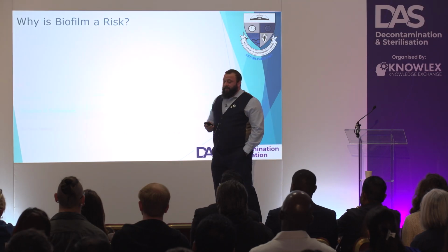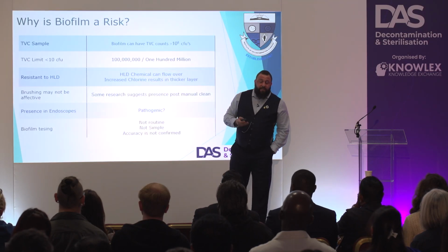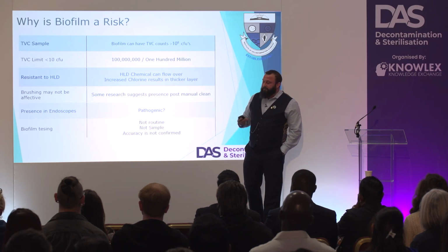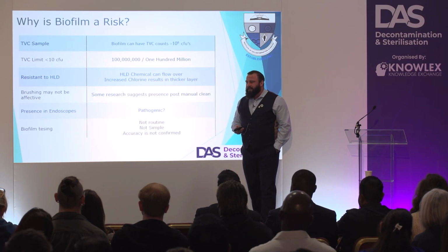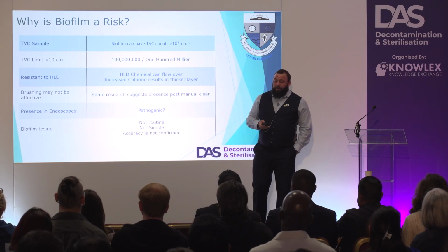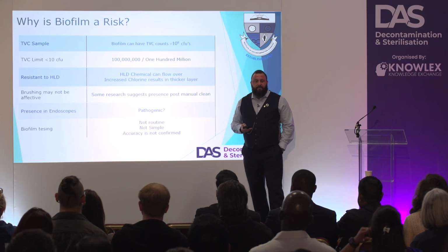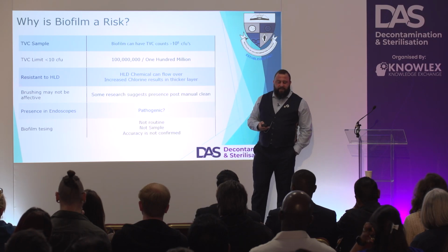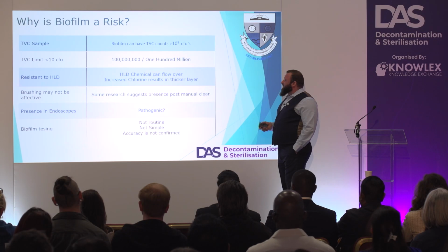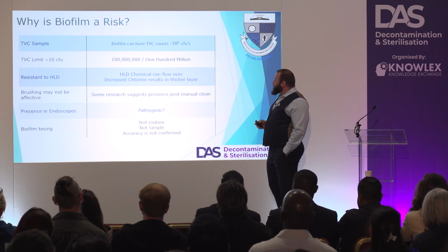So why is biofilm a risk? As we've already said, for TVC samples we have a maximum of 10 CFUs. Biofilm can contain 100 million CFUs, 100 million organisms released into your system. It's been proven that biofilms are resistant to high-level chemical disinfection.